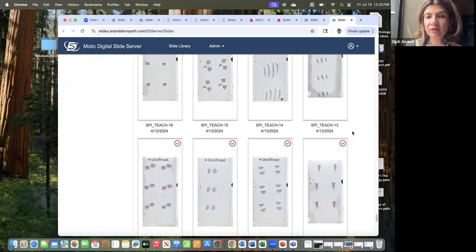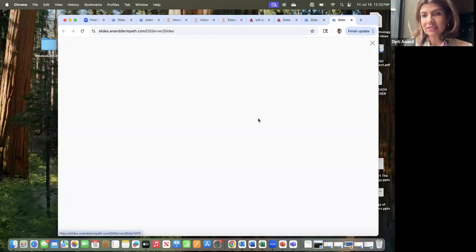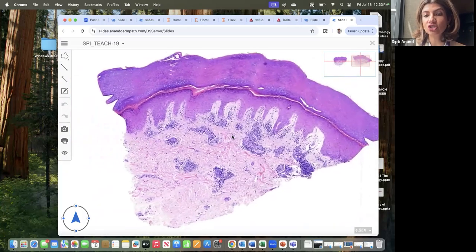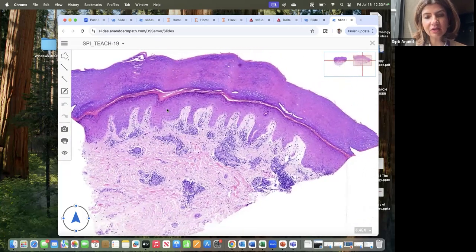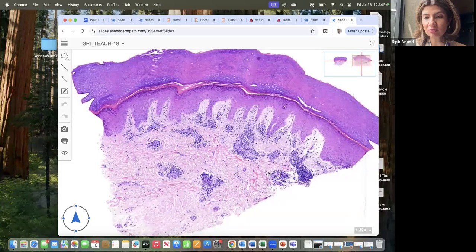So we've talked about arthropod. The next disease would be your pernio. Pernio is chilblains, which is idiopathic chilblains, which occurs due to exposure to cold or extreme temperatures. What you see is on acral skin, and you recognize this because there's stratum lucidum, and you see dermal edema with a perivascular lymphocytic infiltrate. Now, this again is a low power diagnosis. You do not want to go up on high power. You do not typically get any epidermal involvement in idiopathic pernio or chilblains.